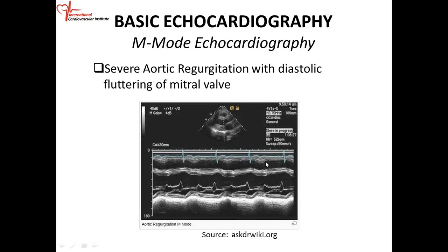So the ECG is on top. So you should be able to do your points. So your D point will be right there. D point. This is your E point. F point is right there. Okay. This is your A point, C point. What they want you to observe: this is the anterior mitral leaflet, and the posterior leaflet is below, which is a mirror image.